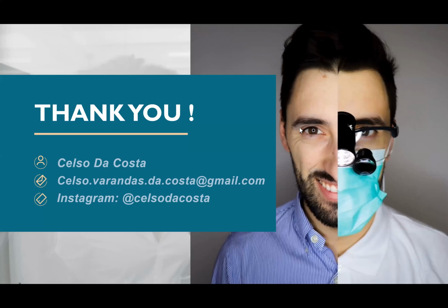I've used Click quite a few times. Some patient feedback is that the shade relapses quite soon. What advice can you give for those cases? Just two pieces of advice. One, check the motivation and the home care of your patient. And second, if you're seeing this a lot, maybe the prophylaxis isn't at its best. Maybe we are getting some biofilm.